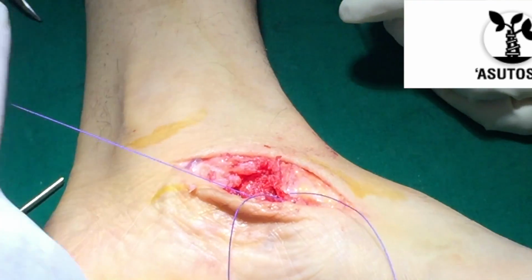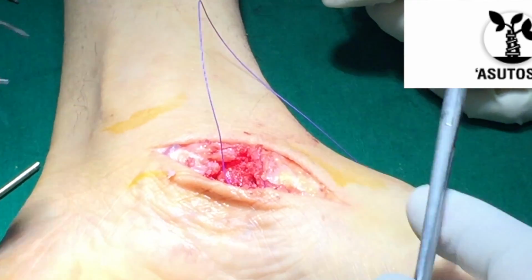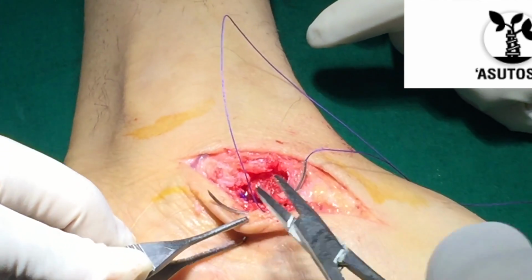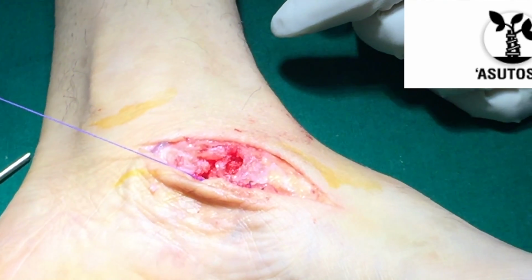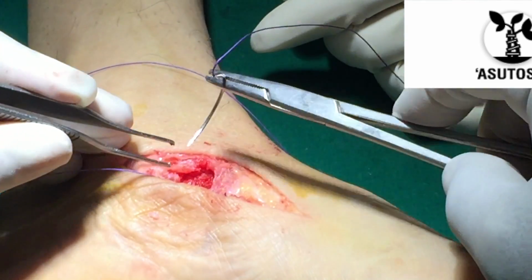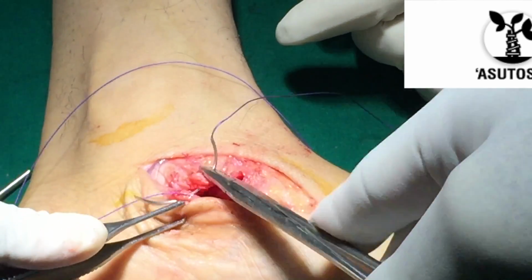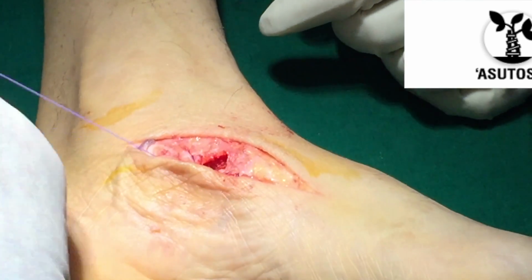We apply a small dressing over the localized incision portion and give a cast that we remove after 6 to 8 weeks. This cast is applied in cavovarus position. The cast is not removed unless there is very severe bleeding or any neurological deficit or neurovascular compromise.